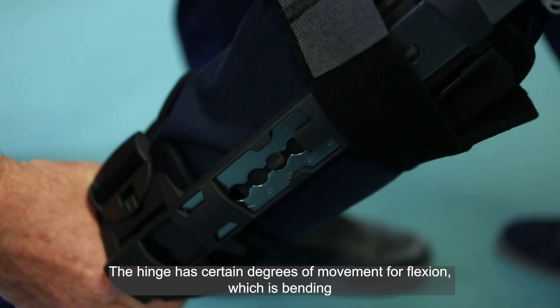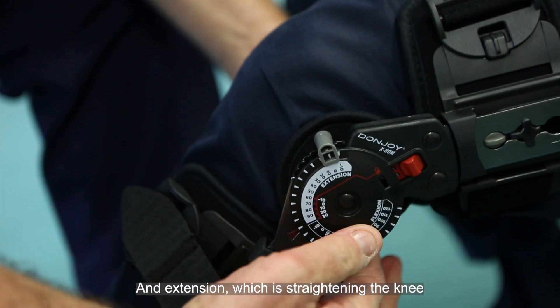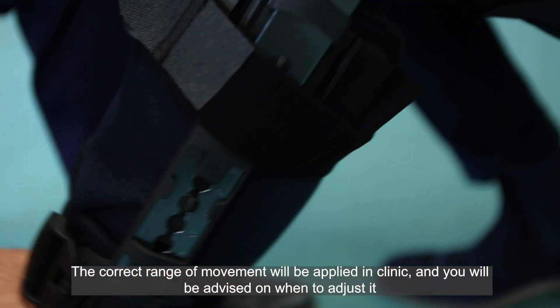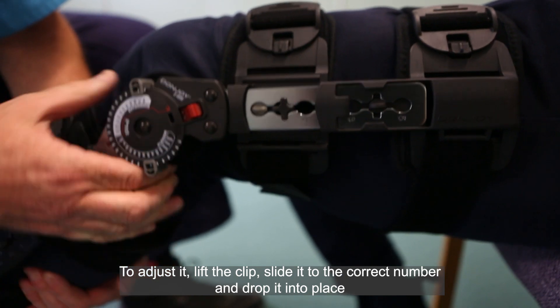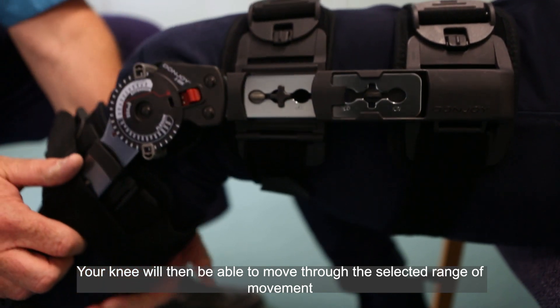The hinge has certain degrees of movement for flexion, which is bending, and extension, which is straightening the knee. The correct range of movement will be applied in clinic and you will be advised on when to adjust it. To adjust it, lift the clip, slide it to the correct number and drop it into place. Your knee will then be able to move through the selected range of movement.